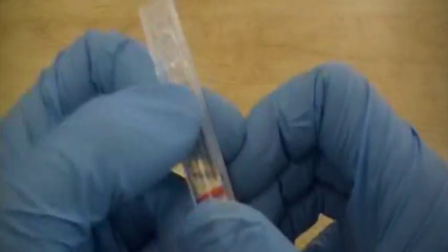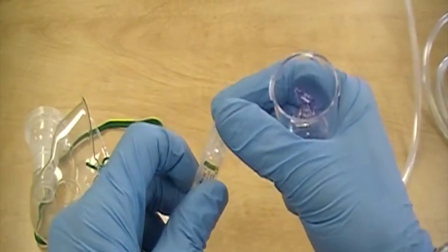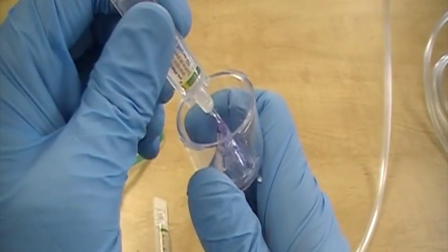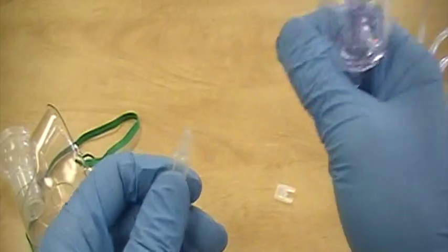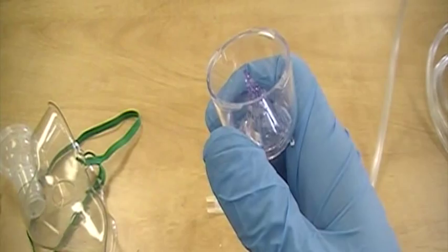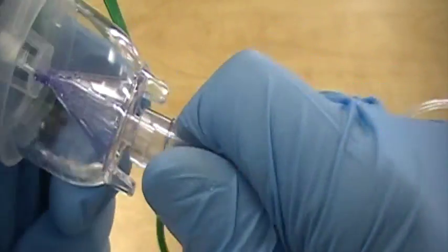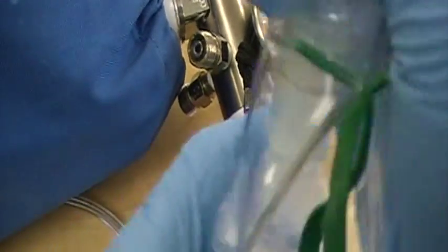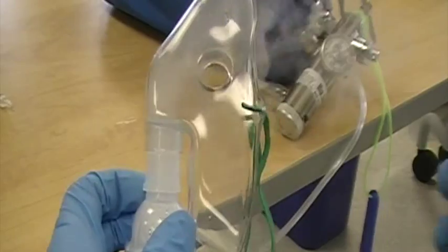Confirm the order for the medication and explain the procedure to the patient. Check for any known allergies, contraindications, or incompatibilities. Check the medication for correct medication, clarity, expiration date, and concentration. Unscrew the nebulizer to expose the medication cup and place the medication inside the cup. Reattach the nebulizer mask. Attach oxygen tubing and select the appropriate flow rate, usually between 6 and 8 liters per minute. Once a mist has formed, attach the mask to the patient.